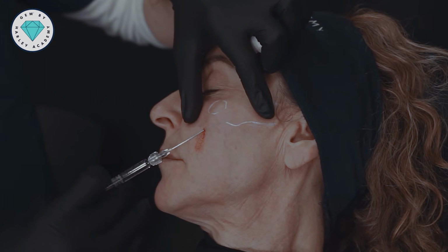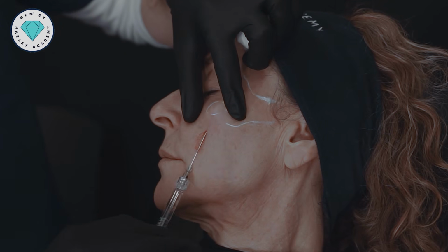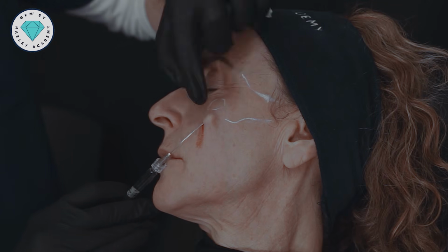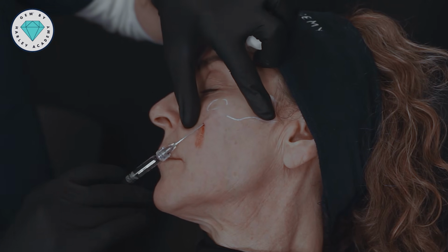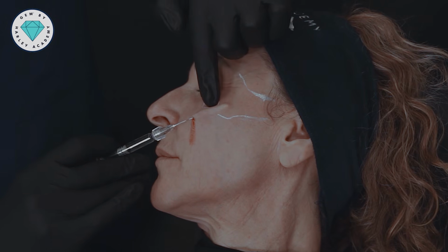Once I've done this, that's about 0.3 mils of Revanesse Contour. I'm now going to move back into my subcutaneous plane like this, and then move along the zygomatic arch itself. I don't need to be deep yet.